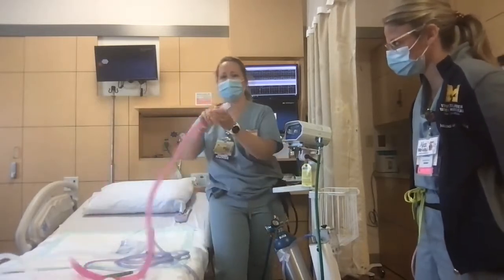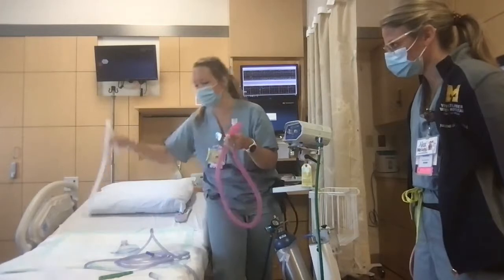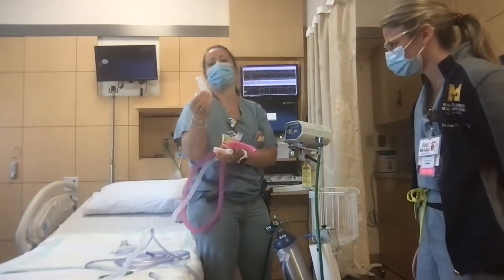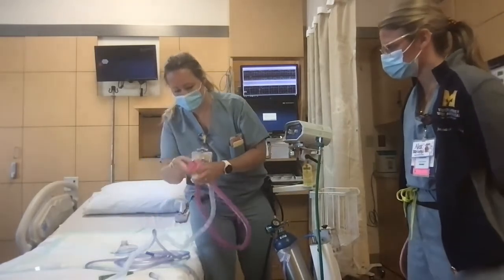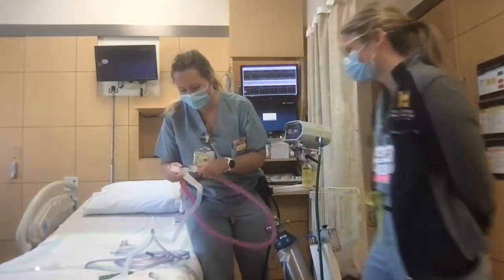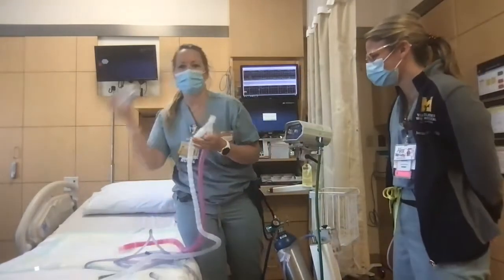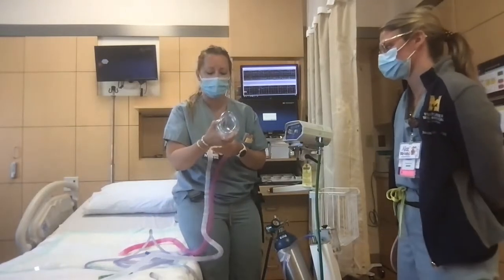The next thing I want to do is set up my mask. You have a pink tube and a clear tube. When you take this one out of the package, there is a mouthpiece that you can just throw away and replace it with the mask. And then my mask, which I inflated with a 10 cc syringe to get a better seal for the patient.